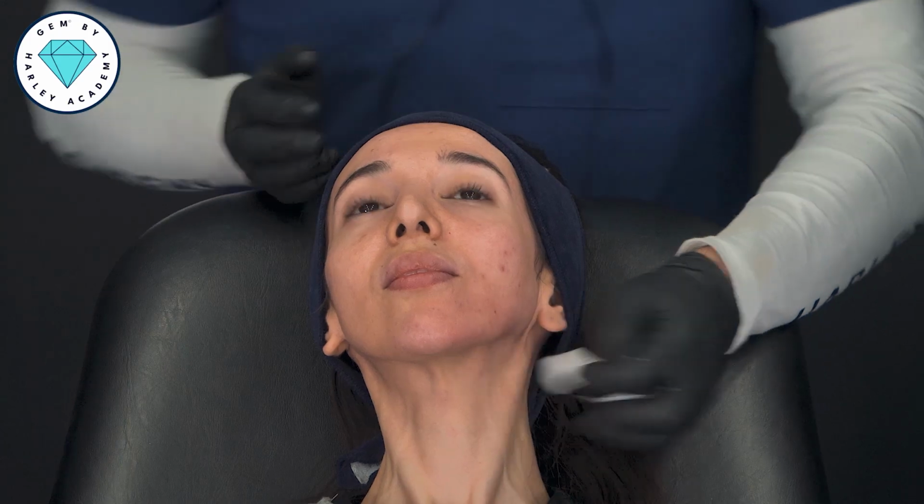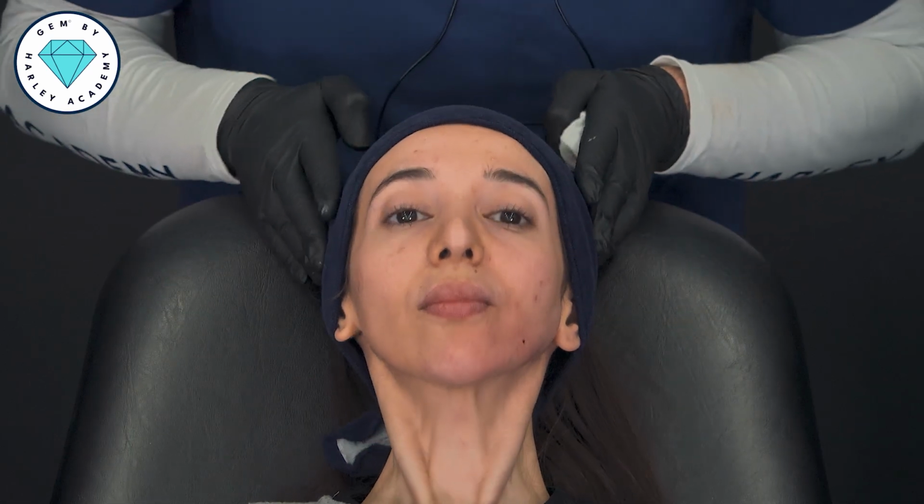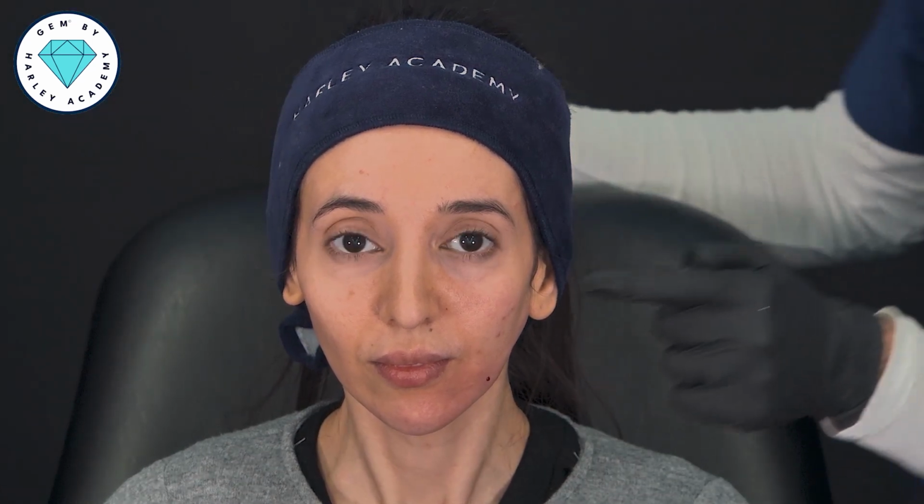And I'm going to treat this entire side off camera and then we'll review the whole face. But I just want to take a look in the camera now to see the results. And I think, as expected, the main benefit that I notice here is the improvement to the apex of the cheek here, but then also the structure that has been created all the way from the jawline down to the chin on this side compared to this side. All right, so let's rest you back and then we'll be back with the final result.